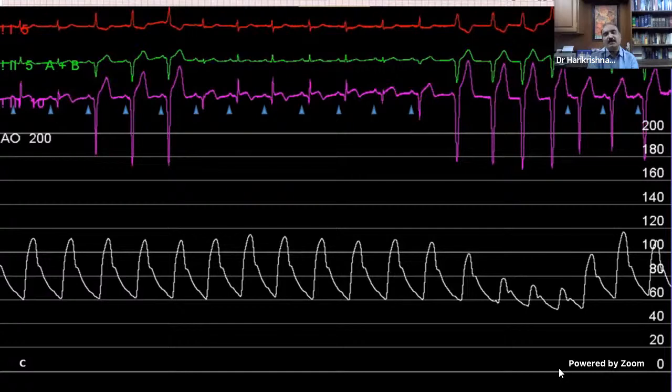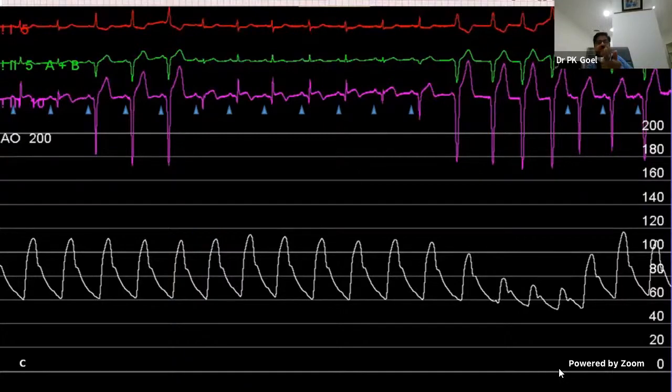Exactly, sir. That is the point I wanted to highlight. Wherever the P wave is there, irrespective of whether the QRS complex is broad or narrow, it is producing significant pressures, sometimes equal to a sinus beat. Sometimes something similar could happen with a pacemaker also. If the escape rate of the pacemaker and the P wave rates are very close together, and you have a hysteresis or a variable AV interval, the pacemaker tries to take over at that overlapping rate. Then the P and QRS may not be coordinated, and your pressure will be lower.